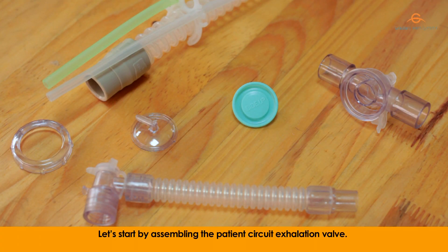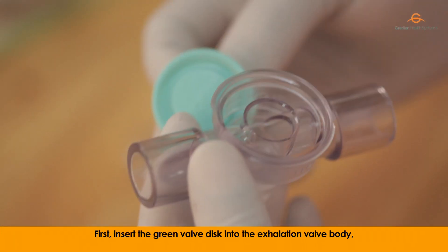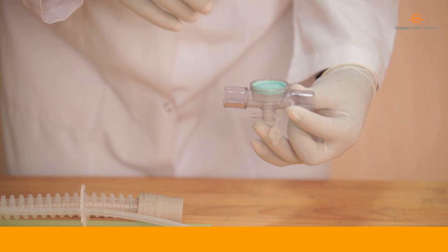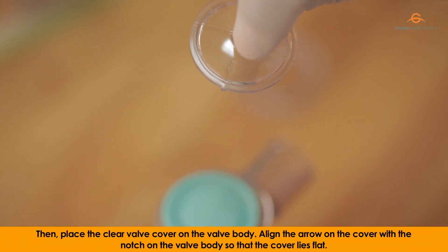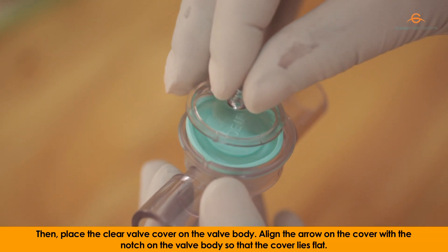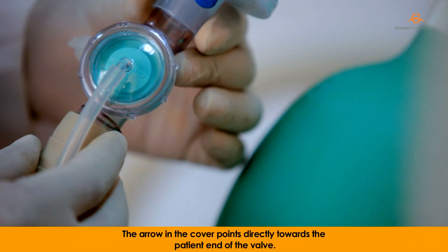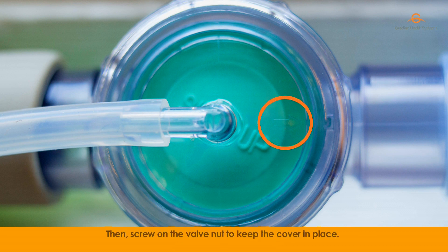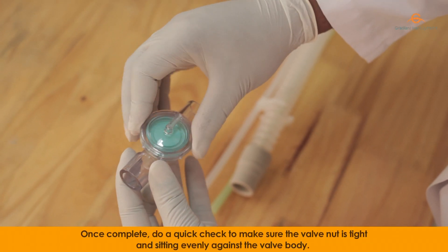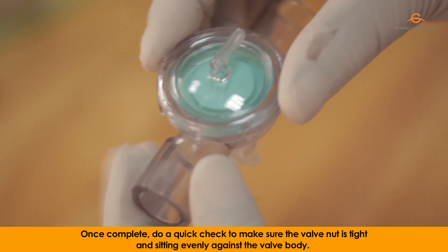Let's start by assembling the patient circuit exhalation valve. First, insert the green valve disc into the exhalation valve body. The label side up should be visible. Then, place the clear valve cover on the valve body. Align the arrow on the cover with the notch on the valve body so that the cover lies flat. The arrow on the cover points directly towards the patient end of the valve. Then, screw the valve nut to keep the cover in place. Once complete, do a quick check to make sure the valve nut is tight and sitting evenly against the valve body.